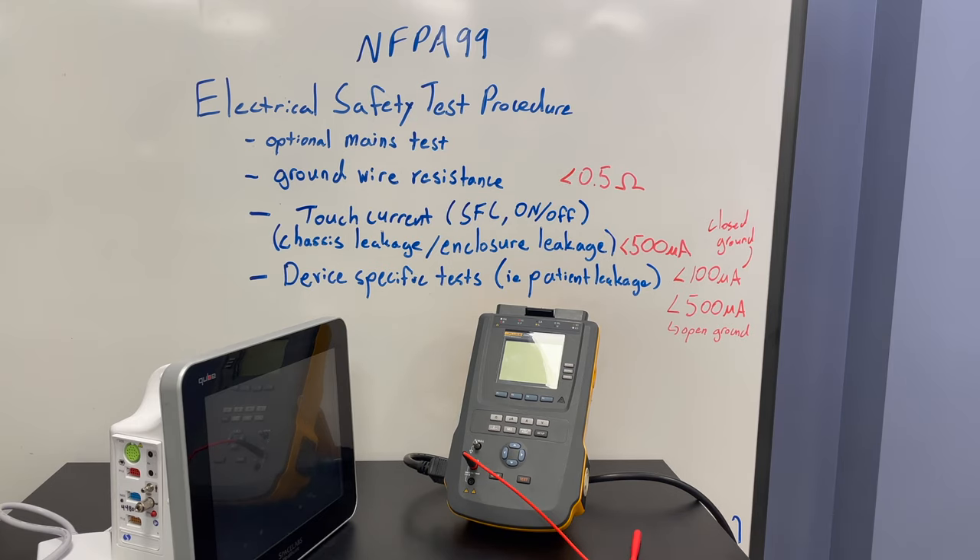Let's take a look at doing the electrical safety tests with the Fluke ESA-612 electrical safety analyzer. We're going to use a Space Labs Cube patient monitor as our device under test.